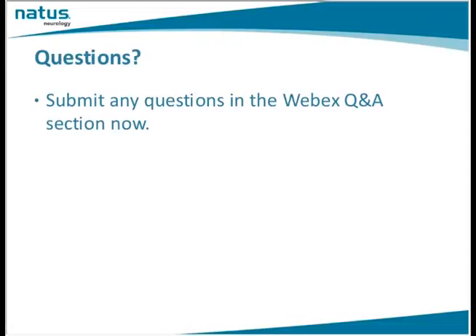All right, you mentioned carotid endarterectomy, Donna Lee. We got one question here. It says, what do I do about electrical interference? So, for instance, if they're doing a cautery, any tips on that?